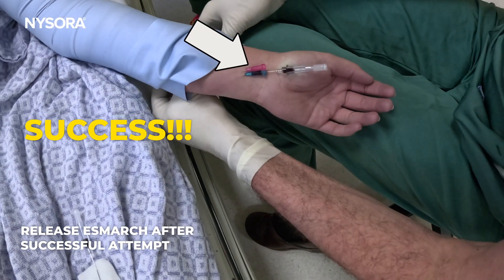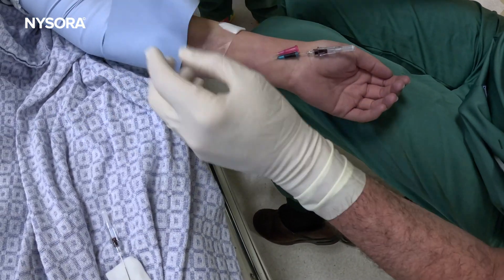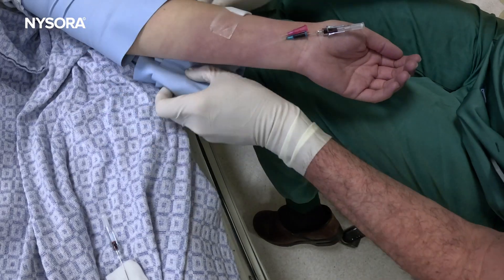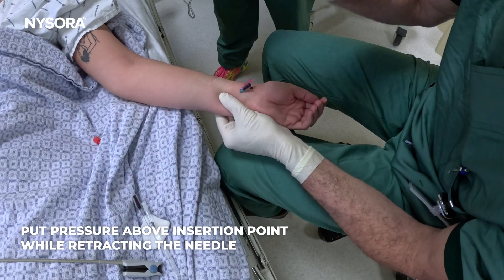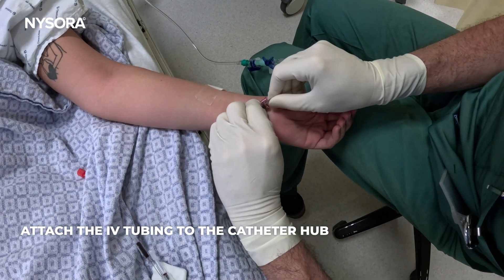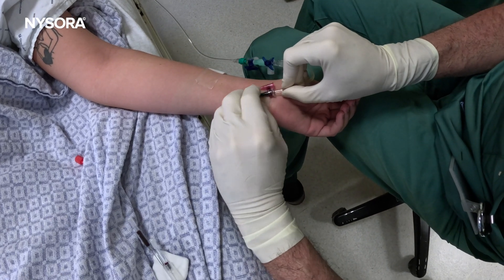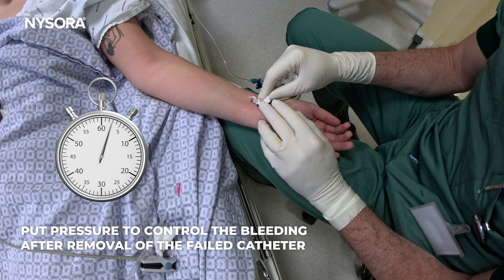So you witnessed a failure and a success. We were in the lumen, but I may have advanced a little too fast. If you remove the pressure too soon, then it bleeds and oozes.